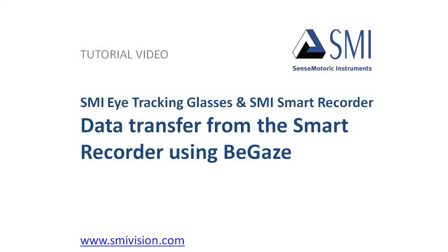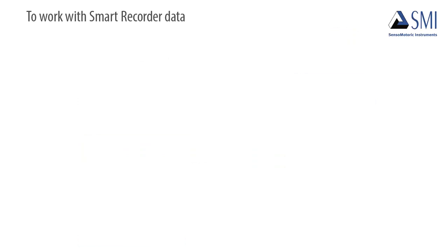Welcome to this SMI tutorial video on data transfer from the SmartRecorder using BeGaze. There are 3 steps to working with SmartRecorder data.